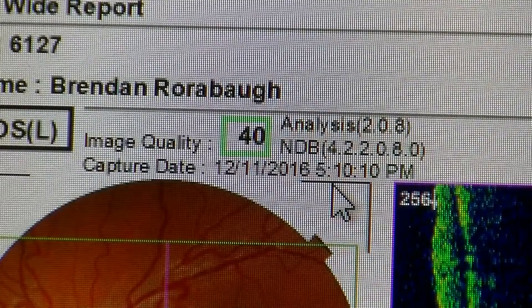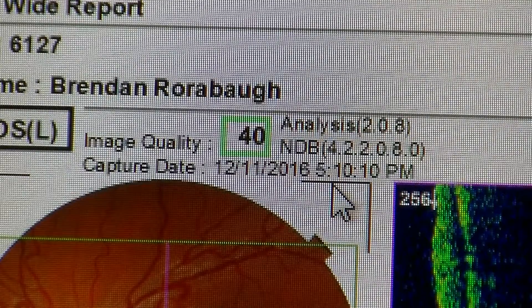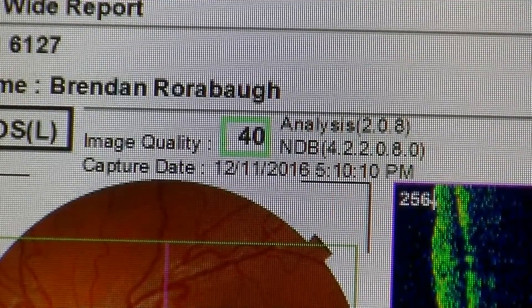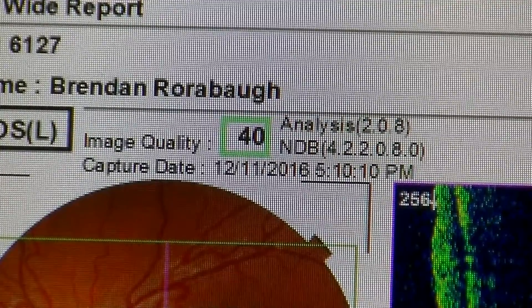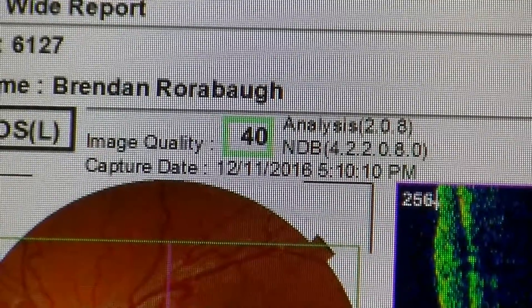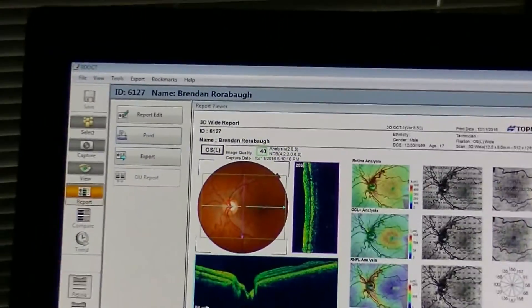So, how do you fix that? Well, there's a date and time setting on the Topcon 3D OCT. But it's not in the regular menu where you can get to it normally. It's in the secret menu, or the hidden menu, or the serial numbered access menu. You go down here and look at your serial number on your unit. As you can see, this one's 102-278. You're going to need to remember that number.